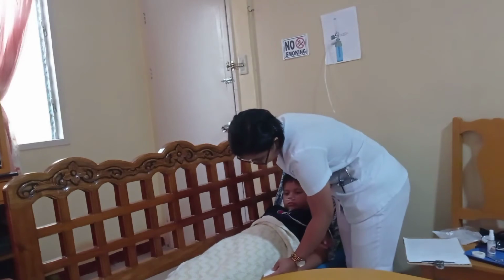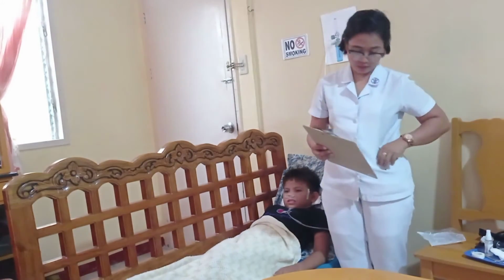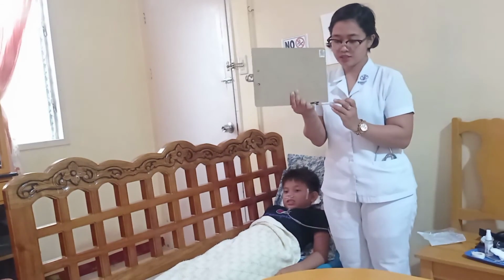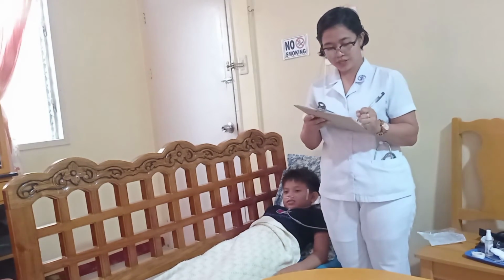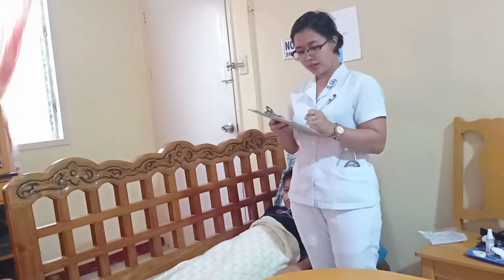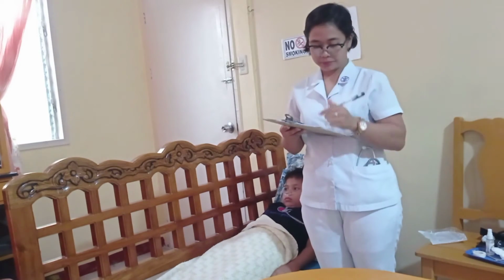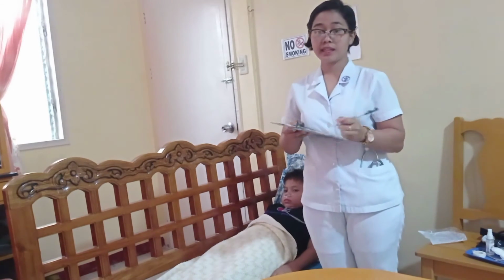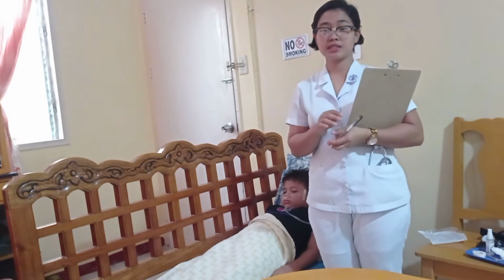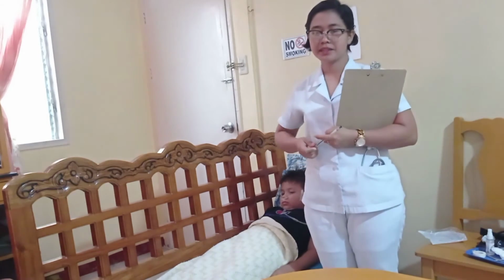Thank you, sir. So we have the oxygen saturation for our patient at 86. The rationale for this is to evaluate the care provided based on the baseline data gathered.